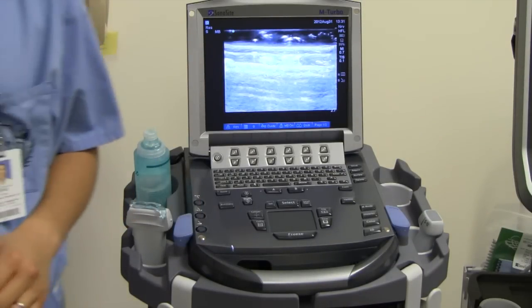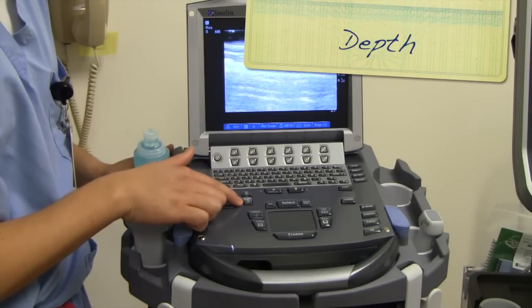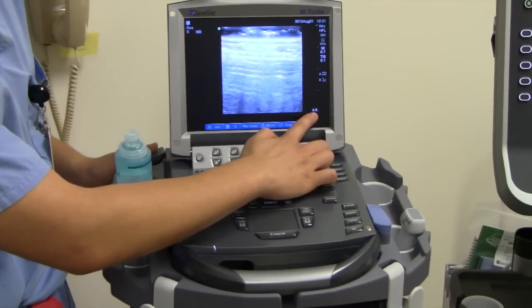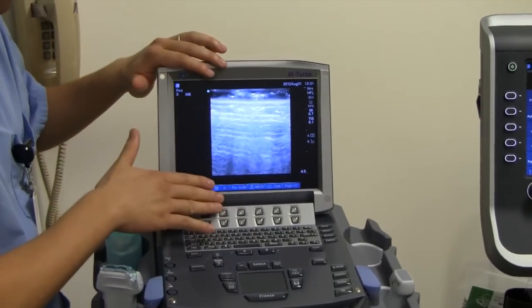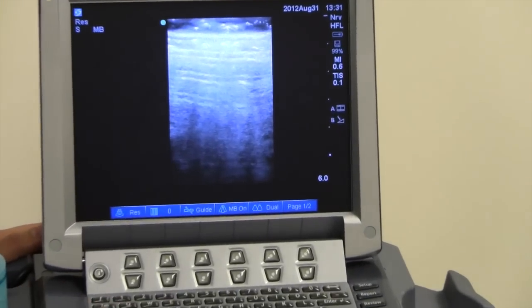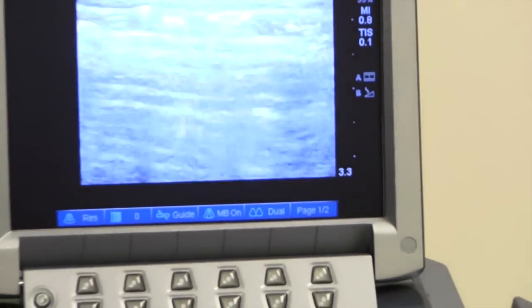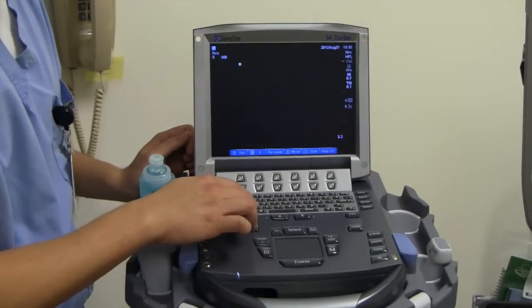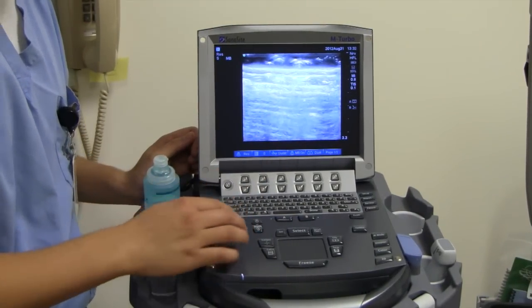The next thing that's really important to learn how to use is the depth. The depth is right here — these two buttons — and when you increase the depth, you're going to see there's a number down here on the bottom left-hand of the screen. It says 4.0 — that's how many centimeters deep you're penetrating, or how far you're looking into the screen. The maximum this probe goes up to is 6 centimeters. When I decrease my depth, that number goes down and the depth goes down also. Your goal is to get whatever structure of interest you have in the middle of the screen, and you adjust your depth accordingly.